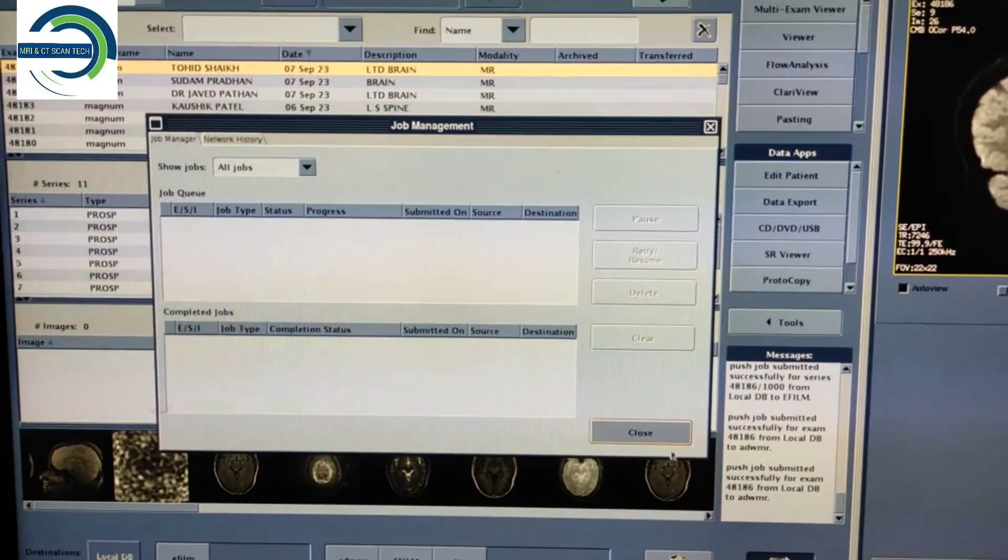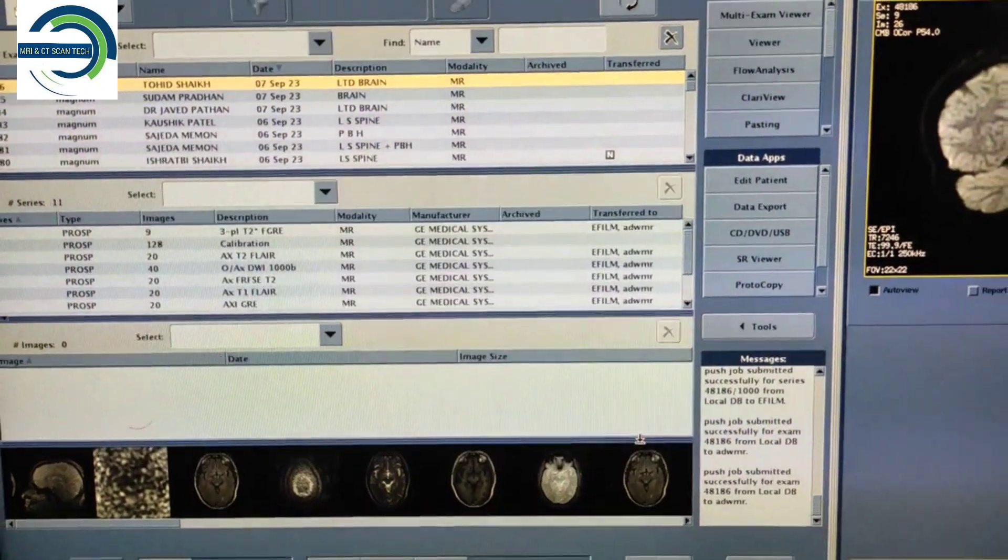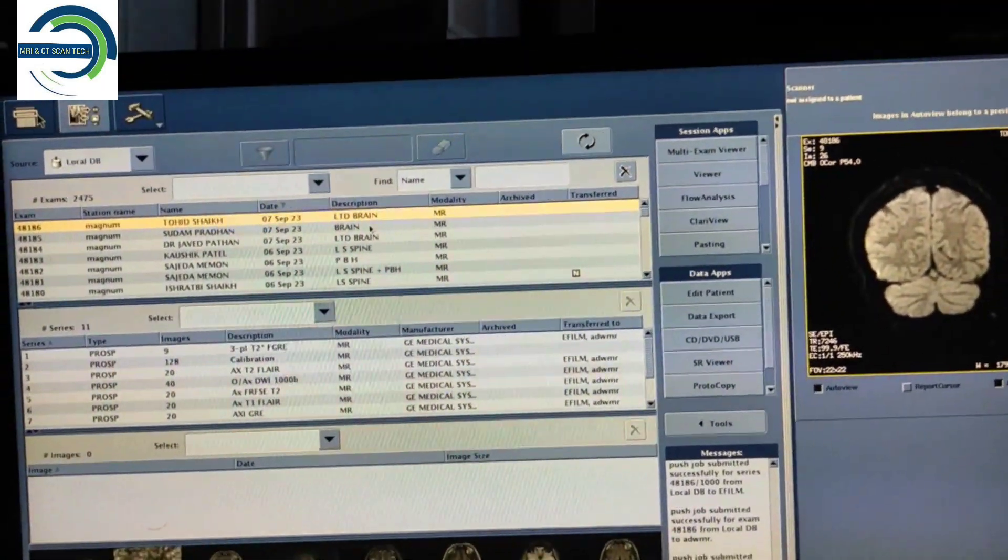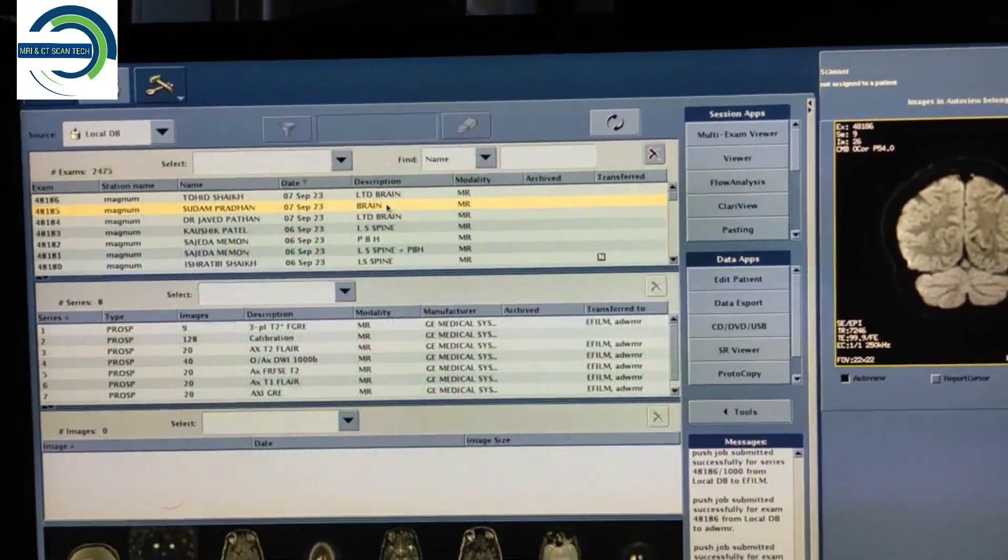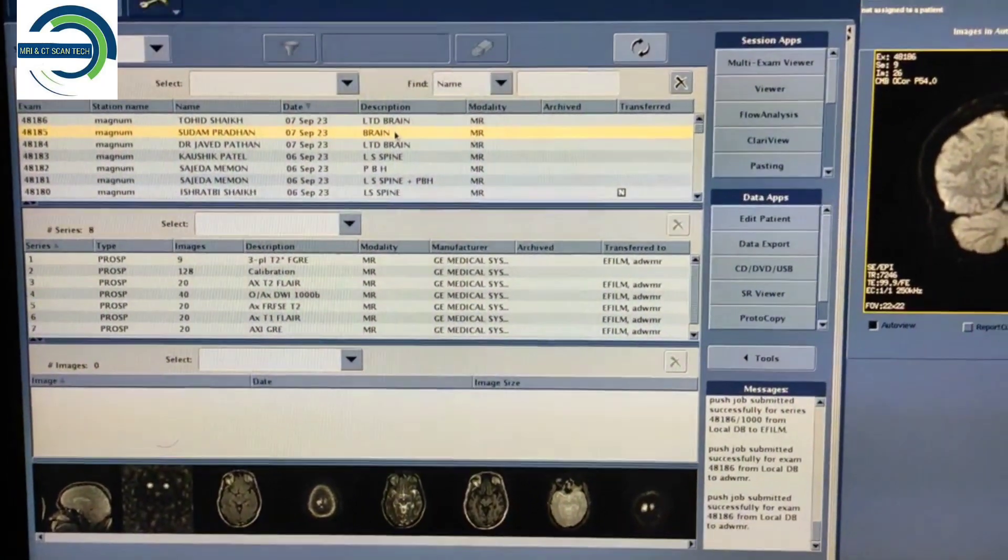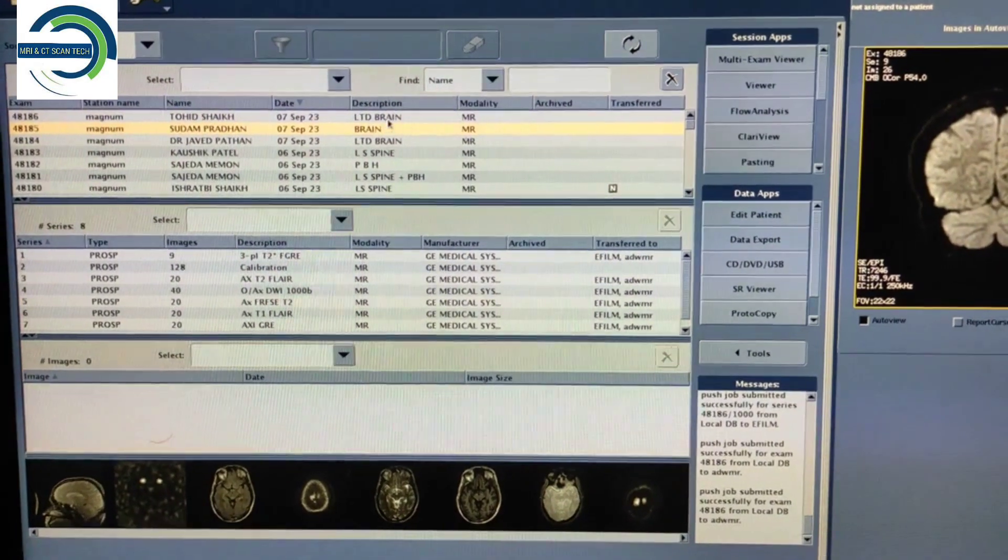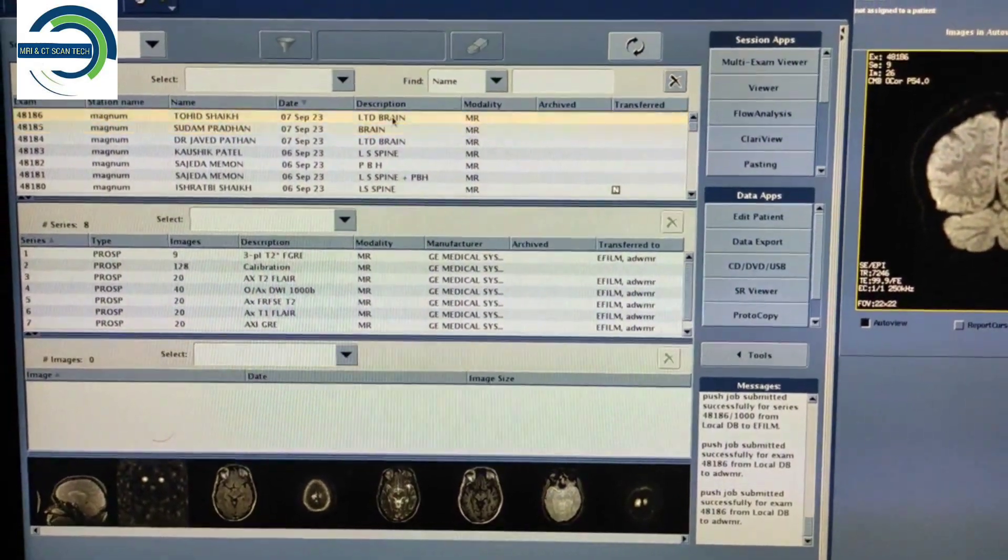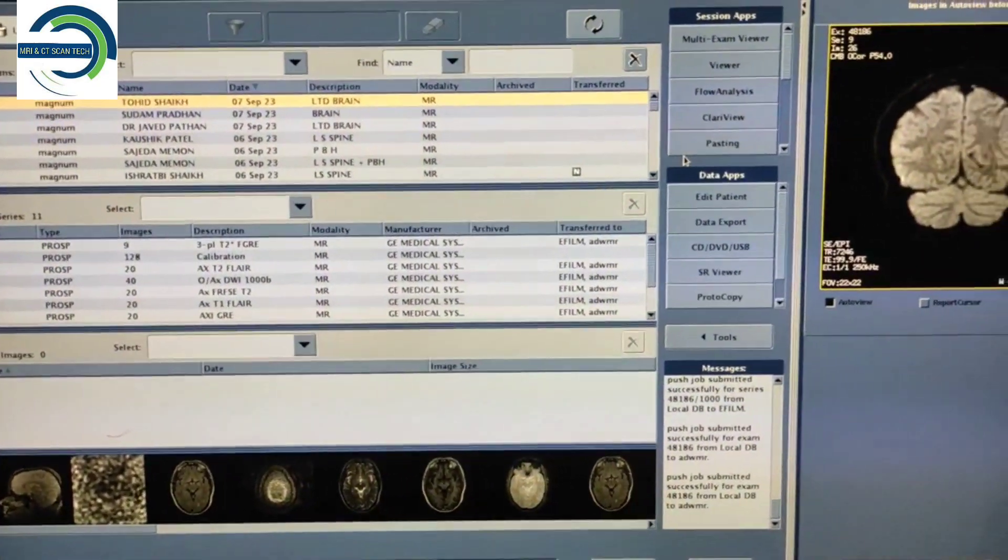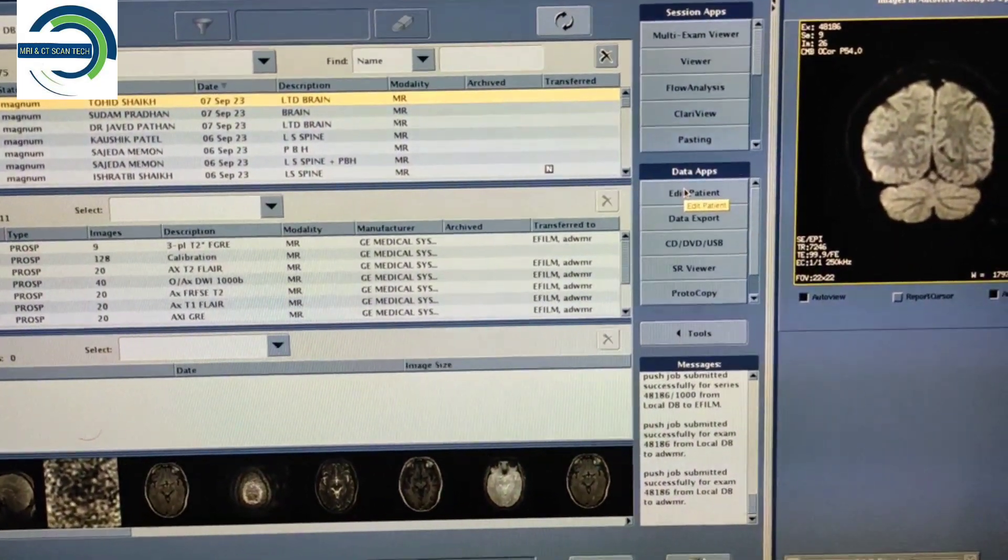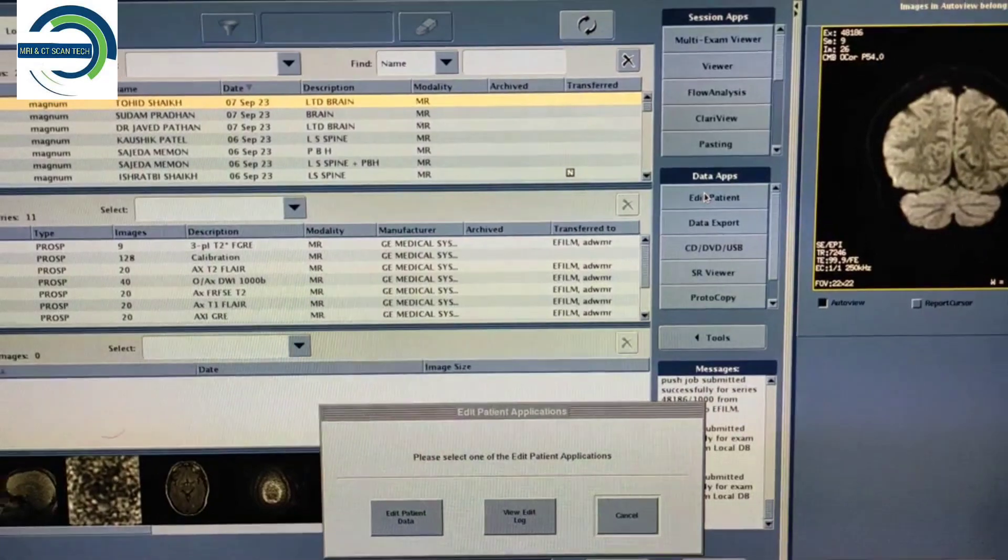You have to remove the series which was in use. Then after, you have to click on the patient name again and select Edit Patient.